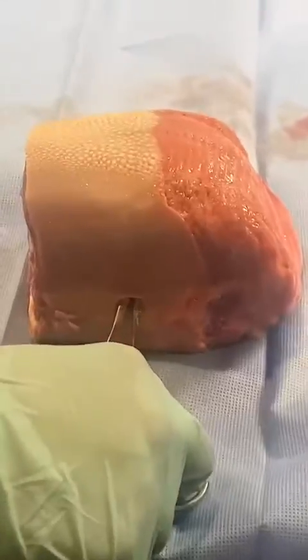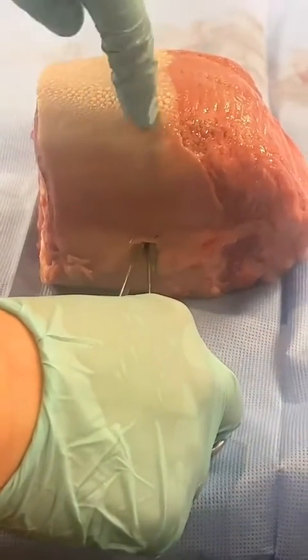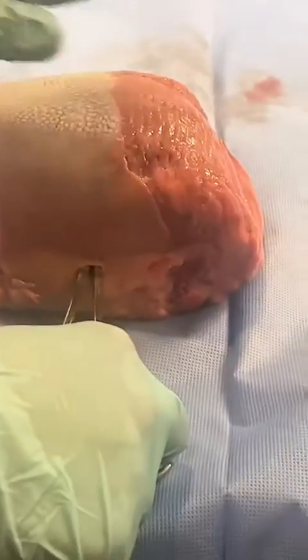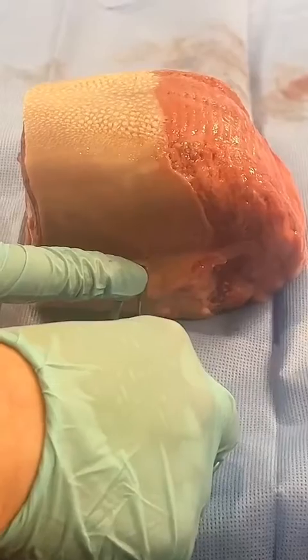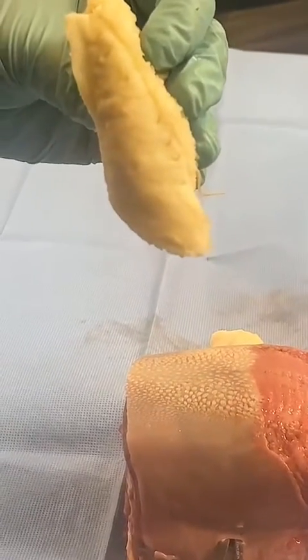This is the beef tongue, and this area represents the perineum, which is the area between the vaginal vault — which would technically be up here — and then the anal rectum, which would be down here. We took the tripe and sewed it into what's going to ultimately be the rectal mucosa.